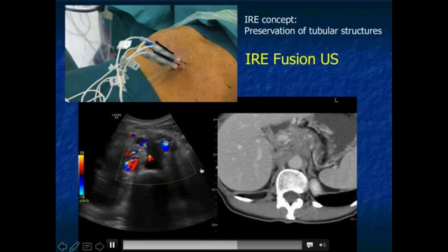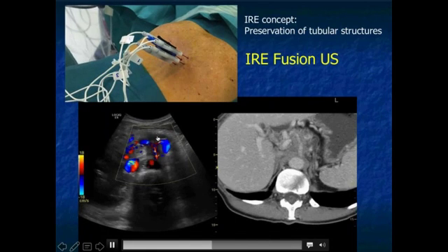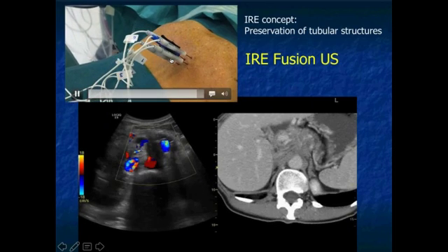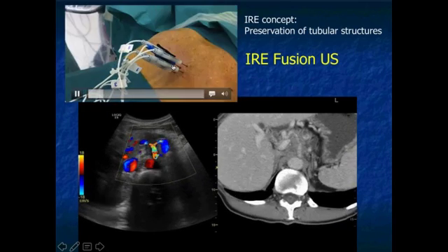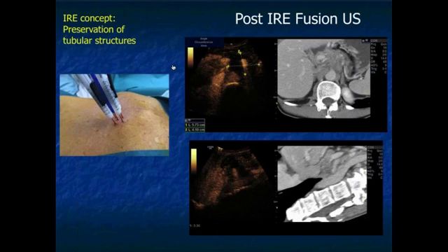And now, I'm sorry, I can't cut out this sound, but you can see here, this tumor is encasing the superior mesenteric artery. You can see here how the electric voltage makes the needles move. And this is, sorry about the noise, I couldn't get it out, but this is immediately post the nano ablation. You can see how there's an ablated area surrounding the still viable, no, this was the celiac trunk.